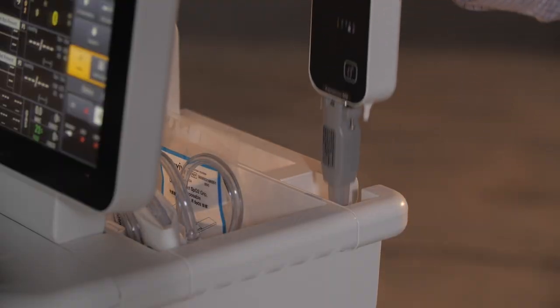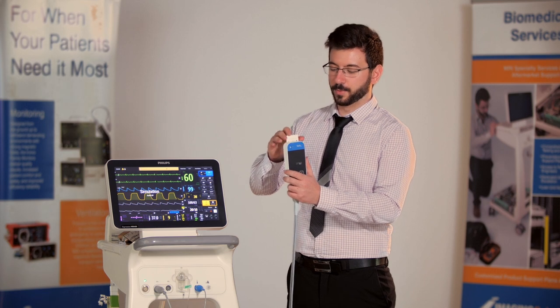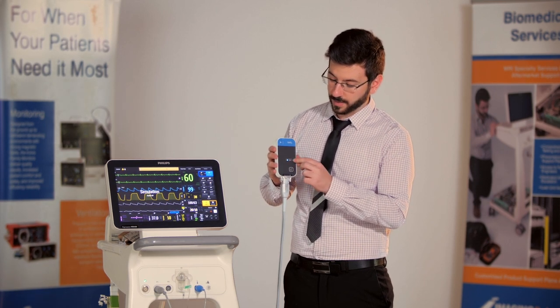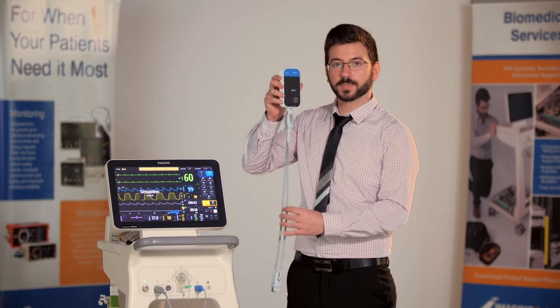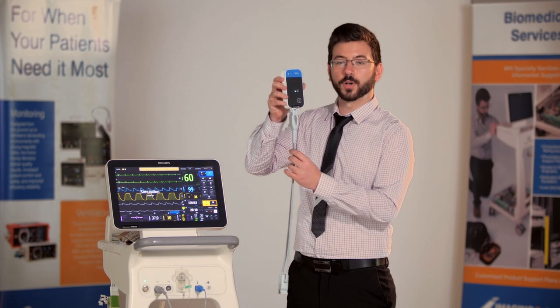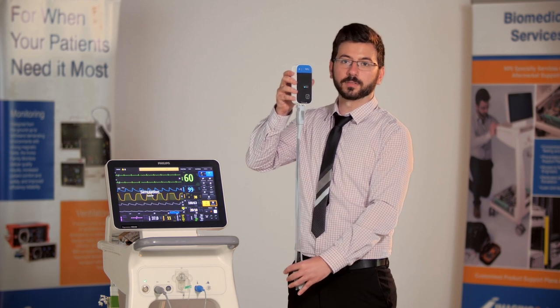This is the wireless SpO2 module that comes with the patient monitor. To turn it on, simply take the battery, put it in the top and click it in. You'll see some flashing lights come on to let you know that it's on. This cable is a fiber optic cable, so it's very sensitive to damage. Make sure you're not bending or twisting it, and that when you store it the cable is hanging down.